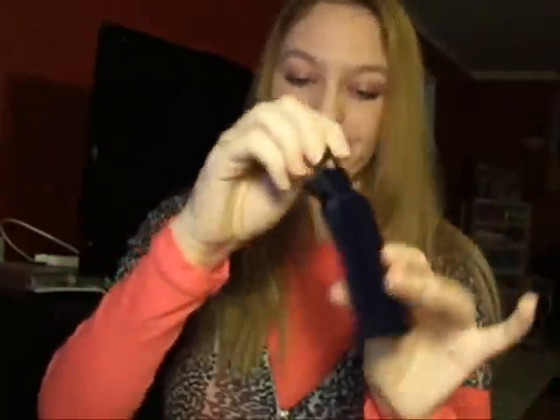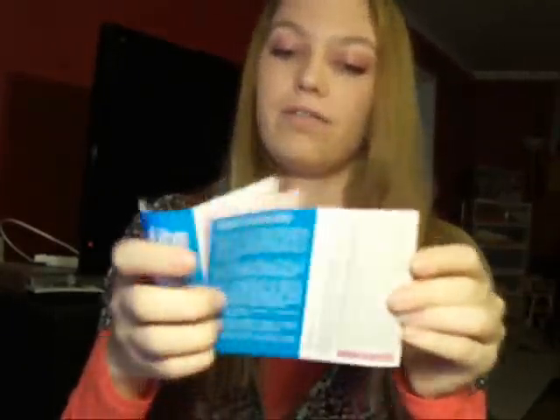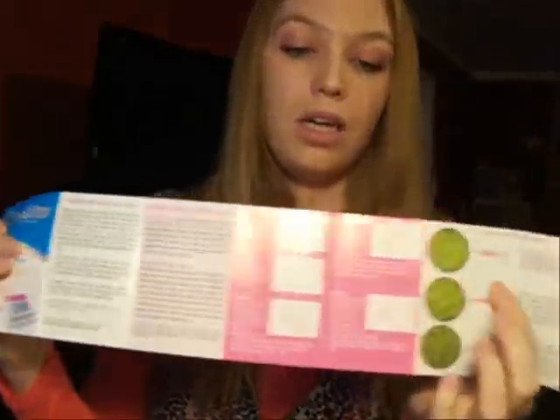Basically what it's looking for is during your ovulation, or when you're close to ovulation, there's extra salt in your saliva, and that's what makes it crystallize. So if you just got through eating an extremely salty meal and you try to test, it's probably going to show that you're getting ready to ovulate when you're really not. So it comes with a little holder pad thingy, and it comes with a little pamphlet, of course, to explain. It gives you detailed instructions. It shows the little diagram again so you can see, okay, I'm not fertile, I'm almost fertile, or I am fertile.